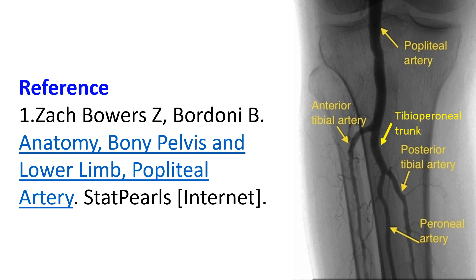Peroneal artery arises from the posterior tibial artery a short distance below its origin. It is also known as the fibular artery. The posterior tibial artery before the origin of the peroneal artery is also called the tibial peroneal trunk.